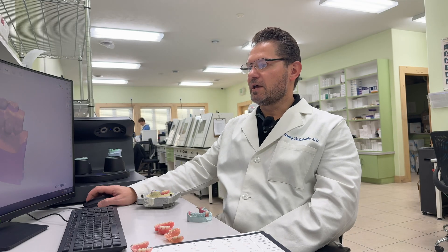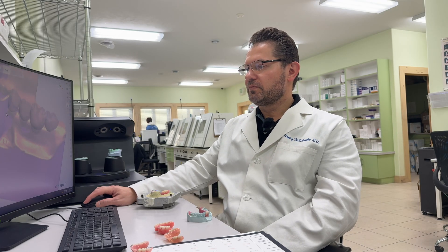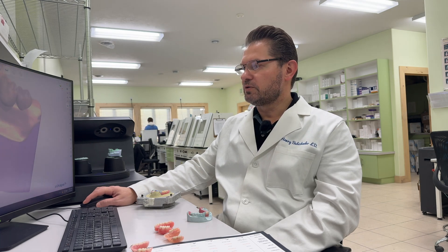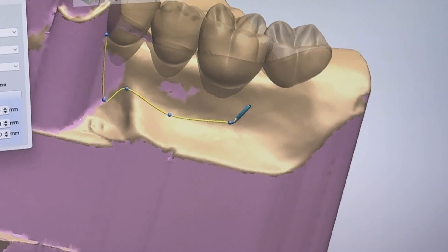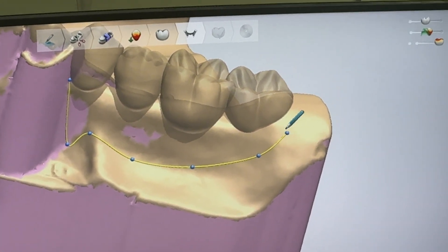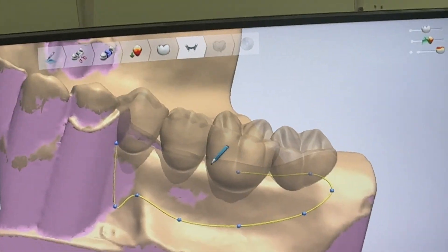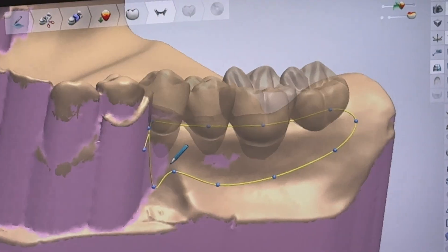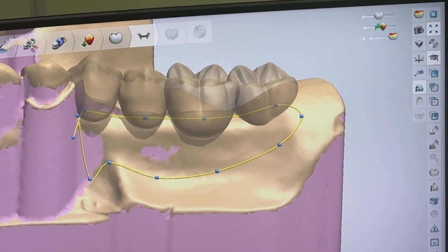In the next step, when you need to add flanges — or what we call the gingiva — you can add them exactly as needed, not overly extended, just as you need it. The flanges will not be overly extended, and you're going to like that.